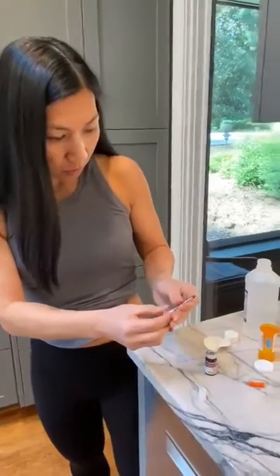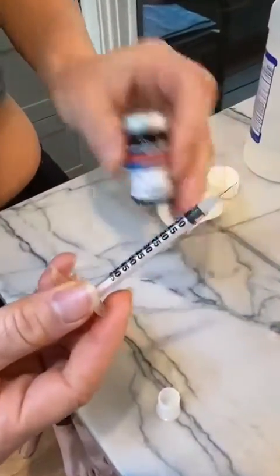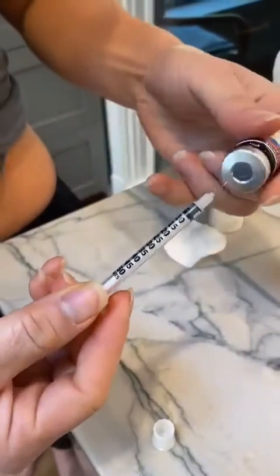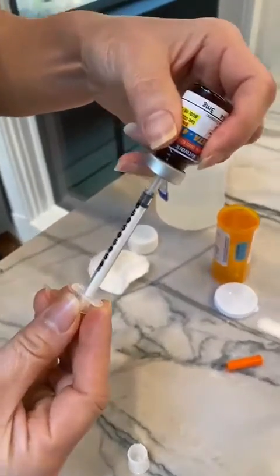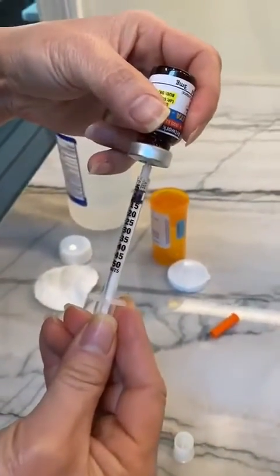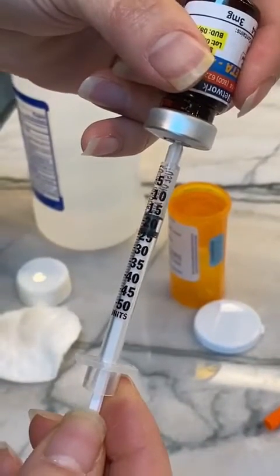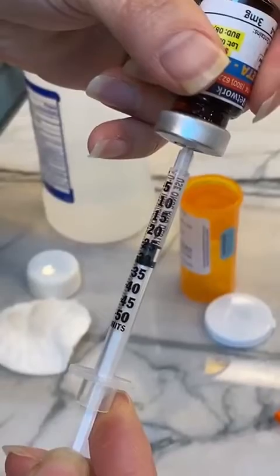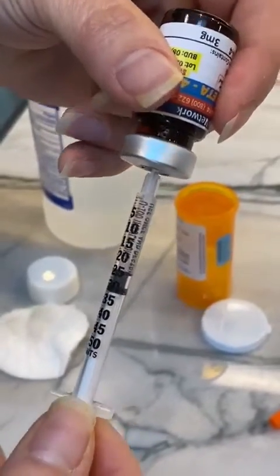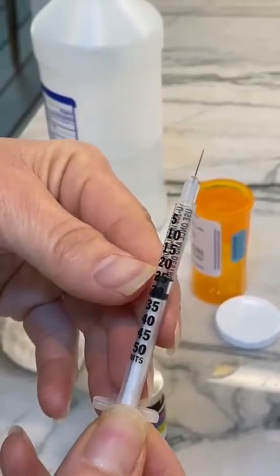You'll see the numbers here on the syringe. When we draw it up, the bevel is up. It's a tiny needle, so you're going to stick it in, tip it upside down, and draw slowly. I'm going to be drawing up 0.25, which is the 25 mark here. You'll see as I stop at 25 — the top line is the 25, not the bottom line.